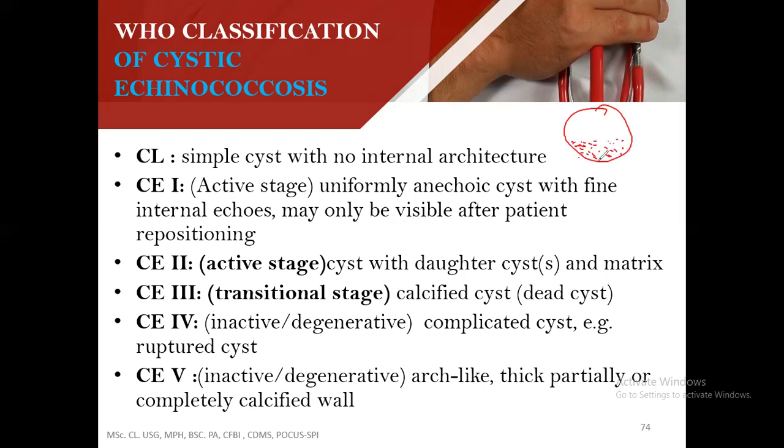So what we use to differentiate, between stage 0 and stage 1, is that with stage 1, you will see the sand here, the hydatid sand. If you let the patient turn to the other side and you capture, you see that the sand will come to this place, because the sand moves. Do you understand? That is how it is. We call it hydatid sand.